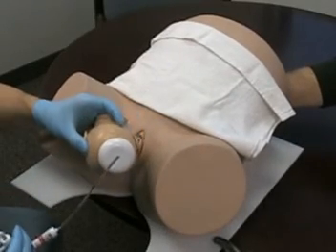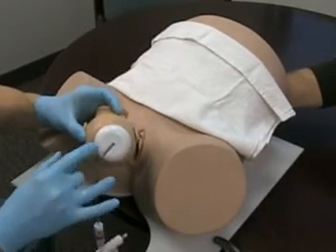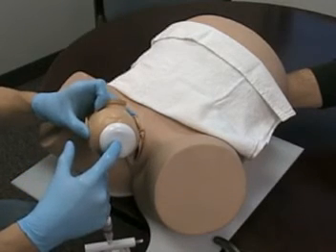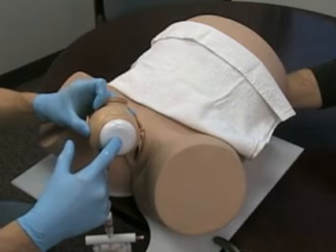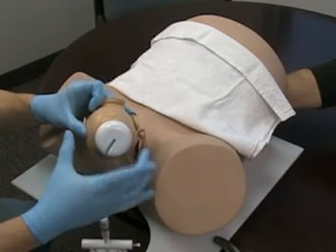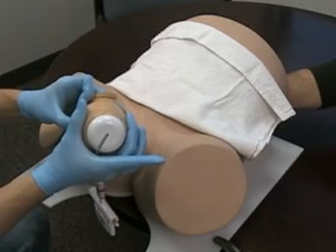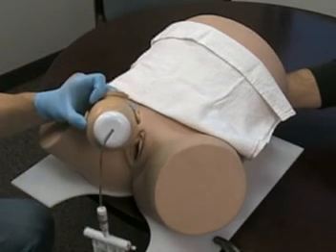In summary, you can see that the cup was placed on the flexion point, 3 centimeters forward of the posterior fontanelle on the sagittal suture. This encouraged the smallest diameter of the fetal head to present to mom's pelvis, thus requiring the least amount of force to conduct the delivery.